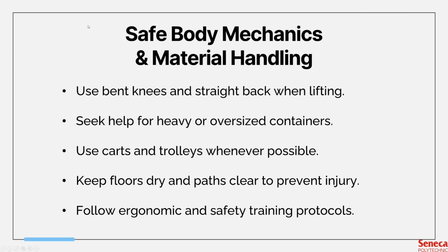So, safe body mechanics and material handling. Containers are often heavy and very awkward to lift, so it's important to know safe body mechanics. You always have to bend your knees and keep your back straight when lifting or lowering containers. Avoid twisting your spine.